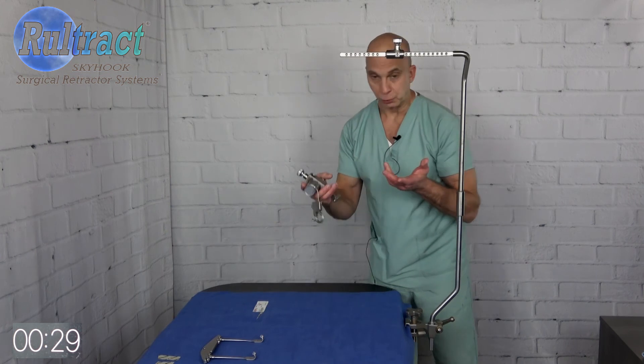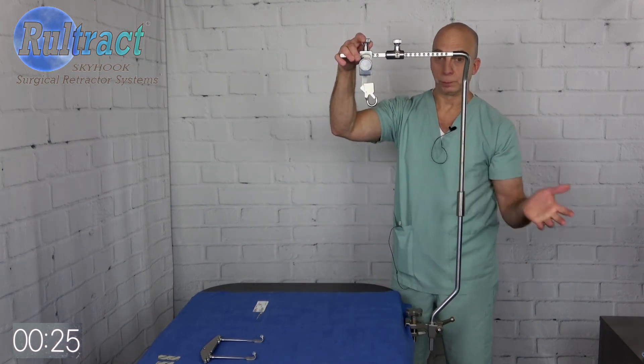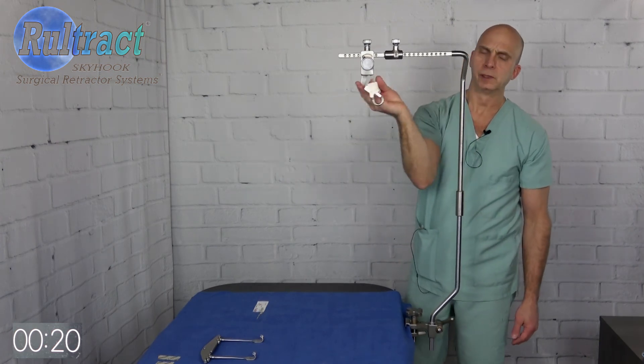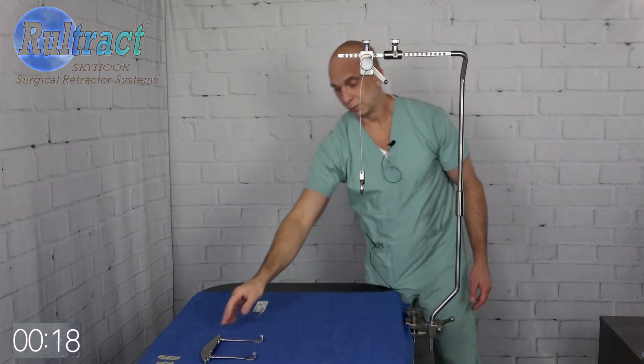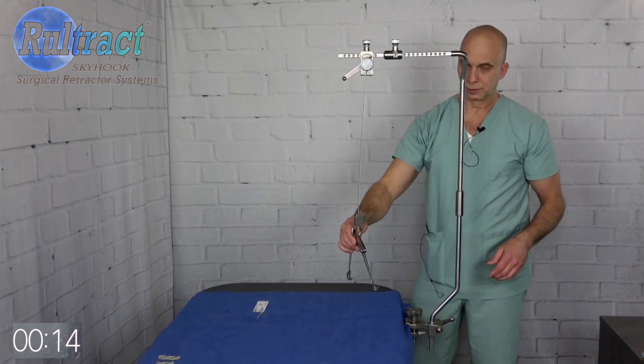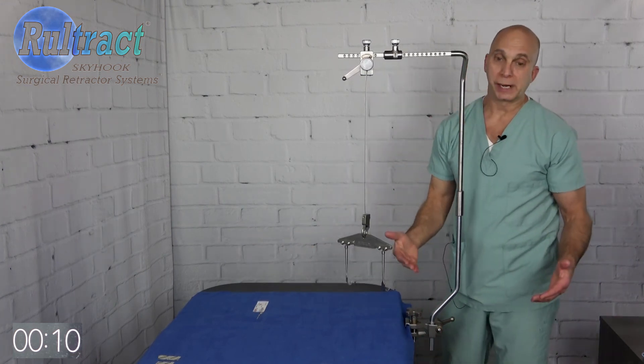Then of course you put your ratchet assembly on — the surgeon is going to place it wherever they think it needs to be. And then your rake plate, which is obvious. So that's the setup of the new Ruraltract obese patient retractor.